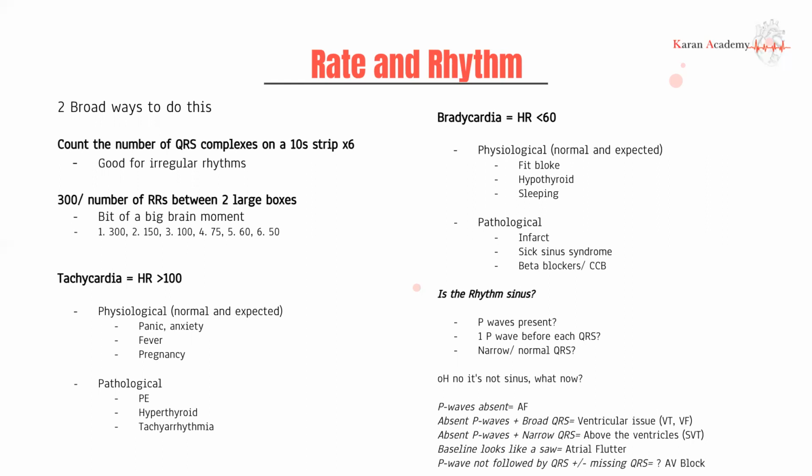Tachycardia is above 100. I'm sure you know this. It can be either physiological or pathological. The one thing you should always know of is a sinus tachy in an otherwise normal looking person who may be short of breath. Always suspect a PE.